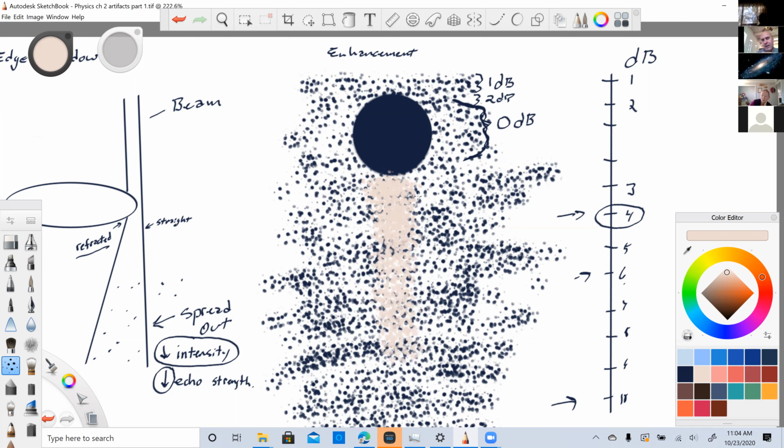This is supposed to represent higher echoes. The machine doesn't understand what happened. It thinks that everything behind this cyst, and that's a cyst, by the way, most likely. Sometimes solid tumors can create enhancement. In fact, if we go back to the breast, if a solid tumor creates just a tiny bit of enhancement, it's a slam dunk, not cancer. But usually it's a cyst. Certainly, if it's obvious, then it has to be a cyst. If it's very subtle, then it might not be. But if it's obvious, it's a cyst.